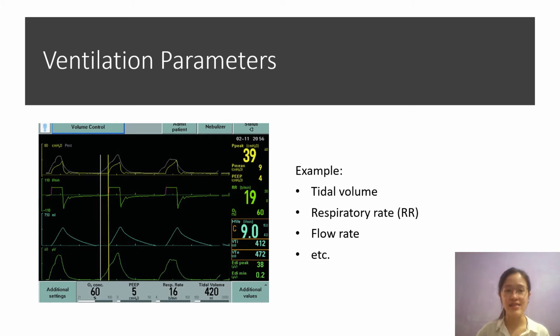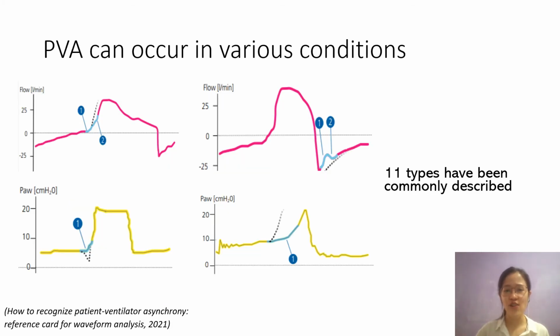Ventilation parameters, such as controlling the amount of flow and the timing of delivery, depend on the respiratory demand of each patient. Since different patients have different demands, and the demand will also change during the process of recovery, asynchrony will occur when the set parameters do not match the patient. Hence, an effective detection method is important to recognize the occurrence of asynchrony in real time, so the ventilation can be adjusted to optimal.